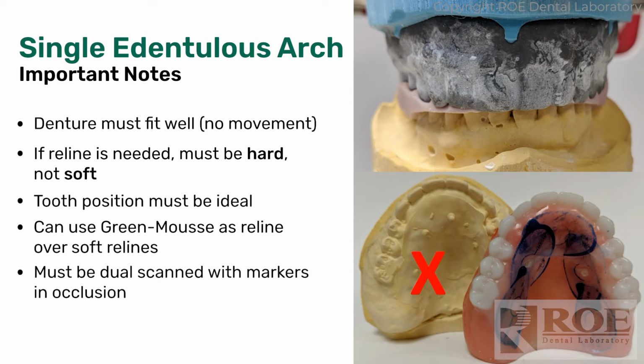So always use the mousse. Tooth position should be ideal. I put must. It should be ideal, very close to what you want. If it's a little bit off, we can make changes. We're very good at redoing setups.